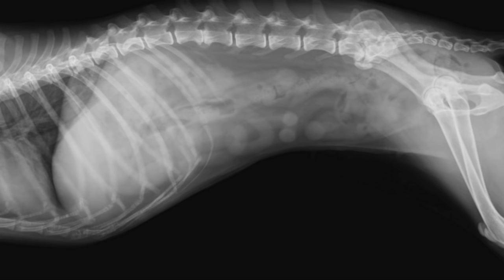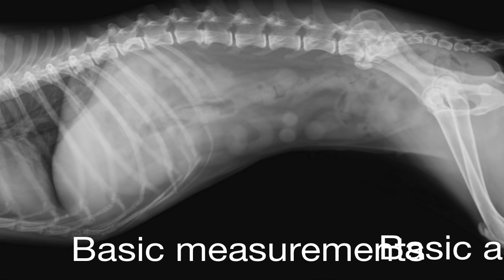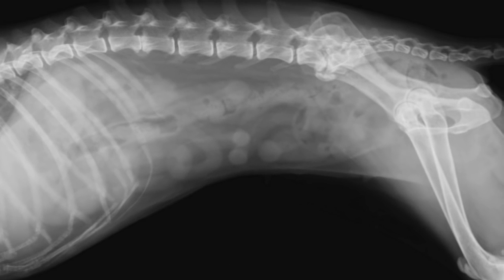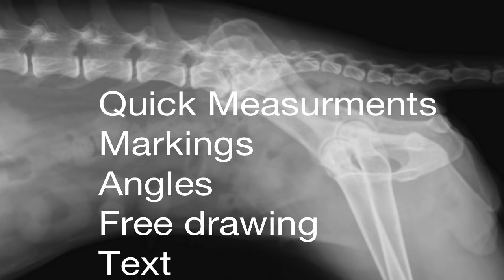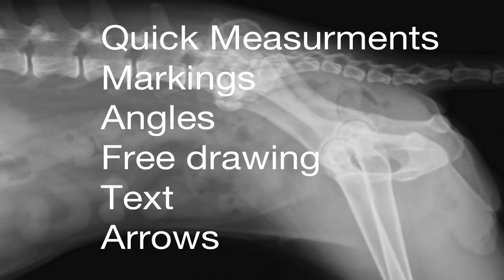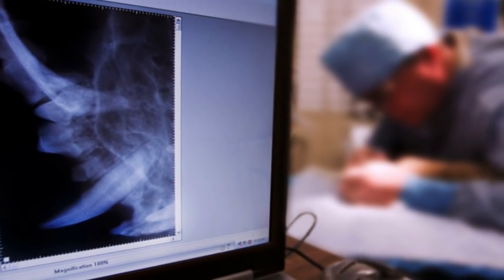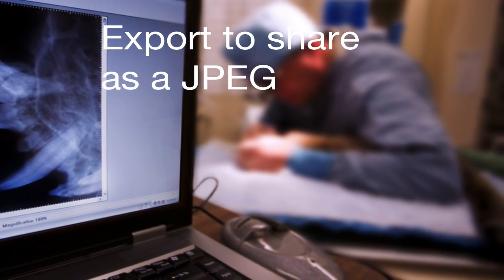The review option brings you to a place where you can do some basic measurements, some basic angles, and marking on the image. Adjusting the screen, you can use quick measurements, markings, angles, free drawings, or put some text or arrows. In the file list is where you can find an image and export it as a JPEG for sharing with another doctor or customer by email.